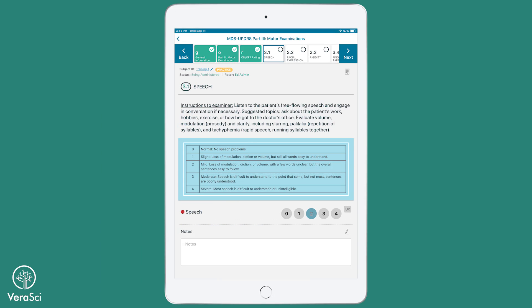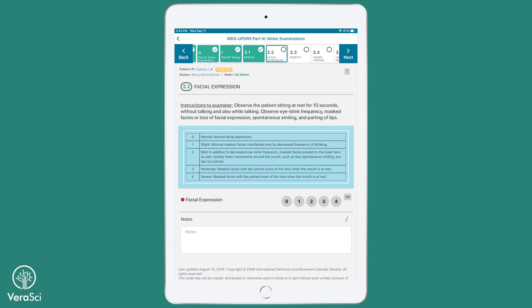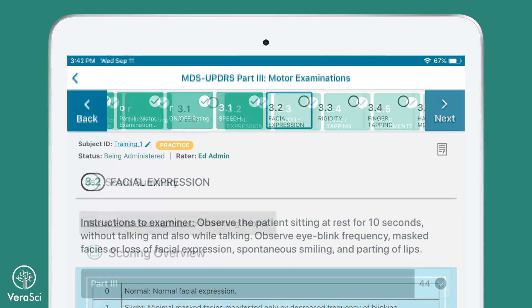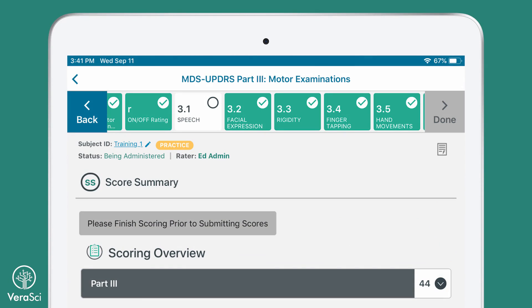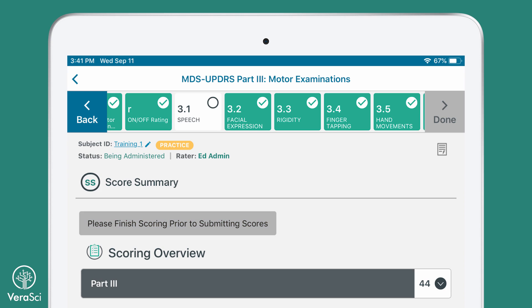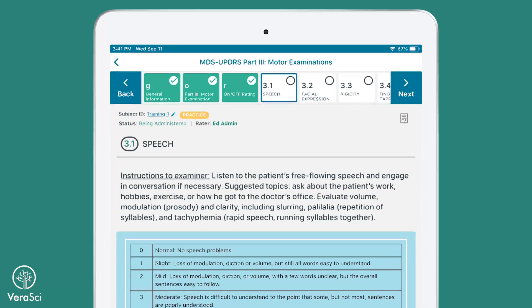The clinician can freely navigate among the various ratings pages for Part 3. When the score summary page is reached at the end of the examination, the device will present a warning message if any required items have not been completed. To revisit any incomplete pages, the clinician simply taps the title of the page in the navigation ribbon or the score summary, and the device will navigate directly to that page.